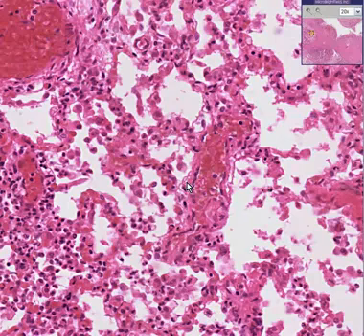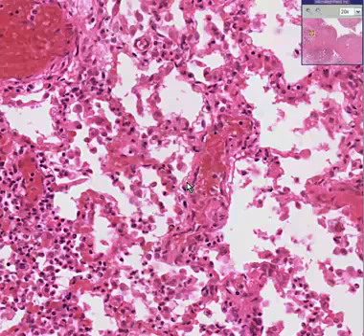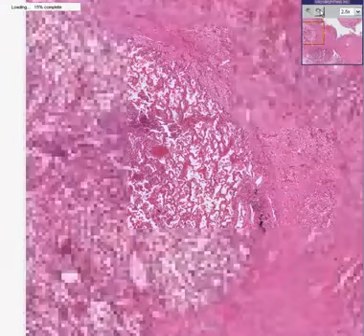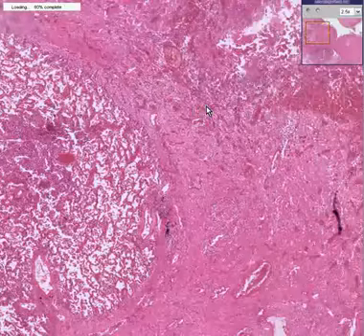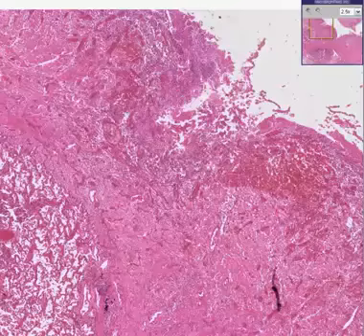And if you want to know what organisms could be inside that abscess, get out a nice microbiology book, because any organism can, and at one time or another has been reported to infect the lung. Or if you want a nice list of the hospital-acquired or acute community-acquired pneumonias, bacterial and viral, you can make a nice little list there as well. What is meant to be demonstrated here is the fact that any type of pneumonia, no matter what's causing it, can cause an abscess, which will have perhaps a nice wall and perhaps a lot of pus on the inside of it. And I thank you very much.